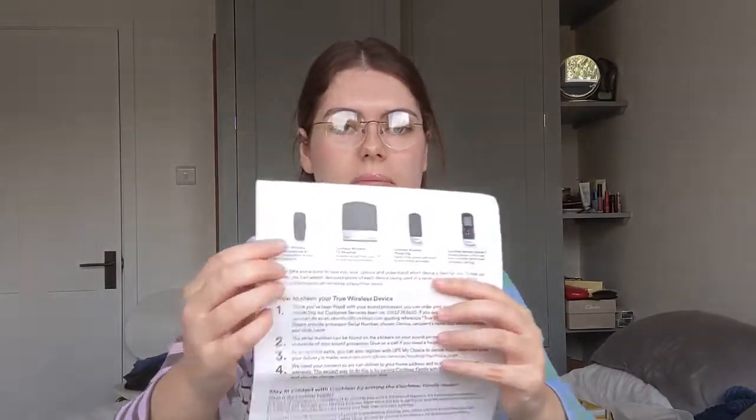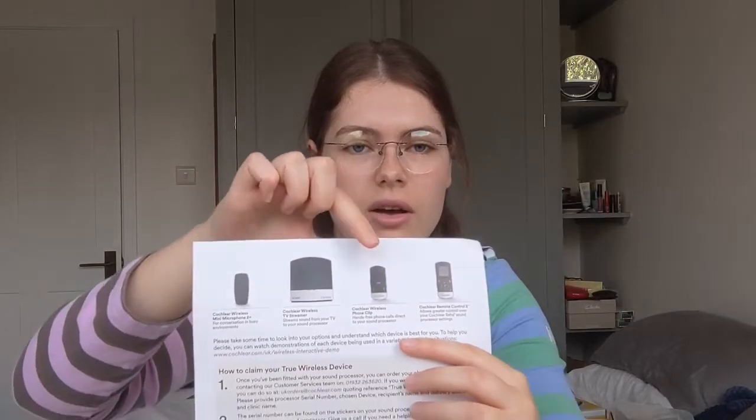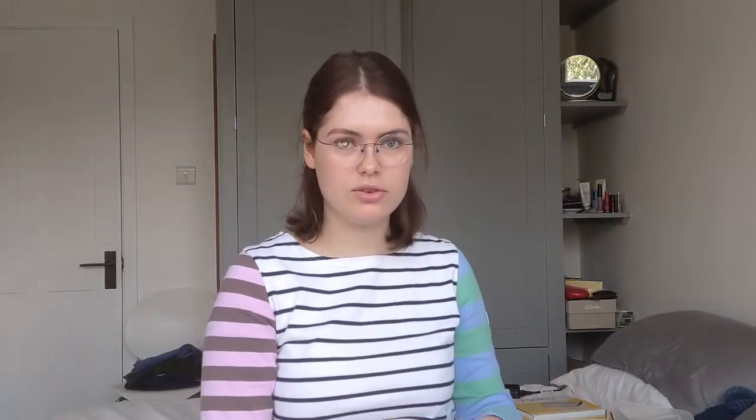There's also a thing to claim your true wireless device. You have the choice of the mini microphone, TV streamer, or phone clip. There's also a remote control option for a bone-anchored hearing aid, which isn't what I've got. You go on their website and choose which one you want — you get one for free. If you want to buy extras, they're about 200 to 300 pounds.